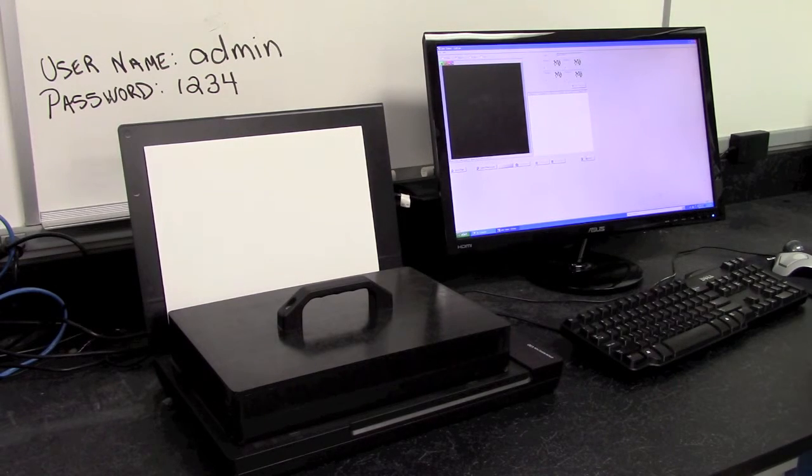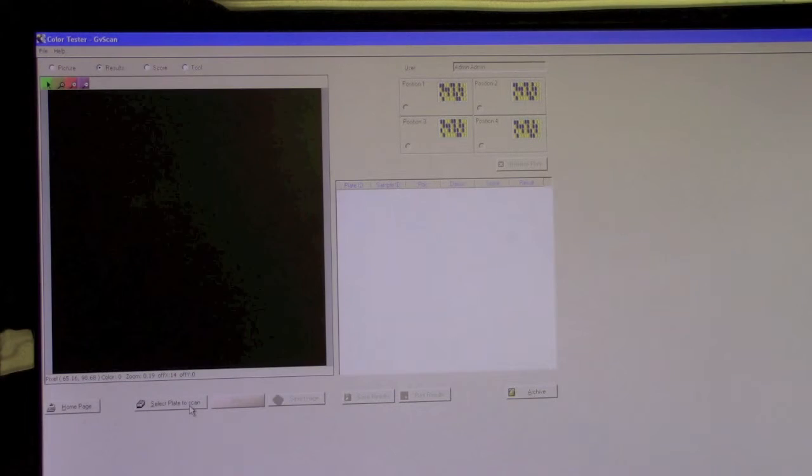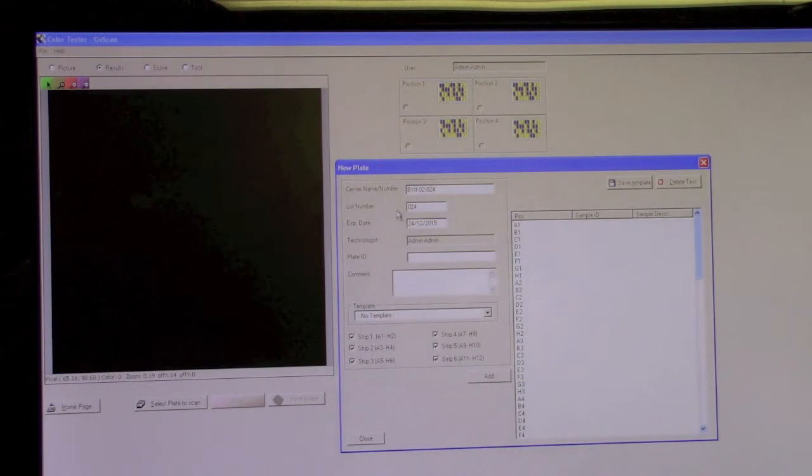So on the software screen, we have a button that says Select Plate to Scan. So we'll select this button, and we're going to here add in the information, the sample information, the plate information, and by hitting the New button, we can put in serial number or plate identification, the date the plate was run.